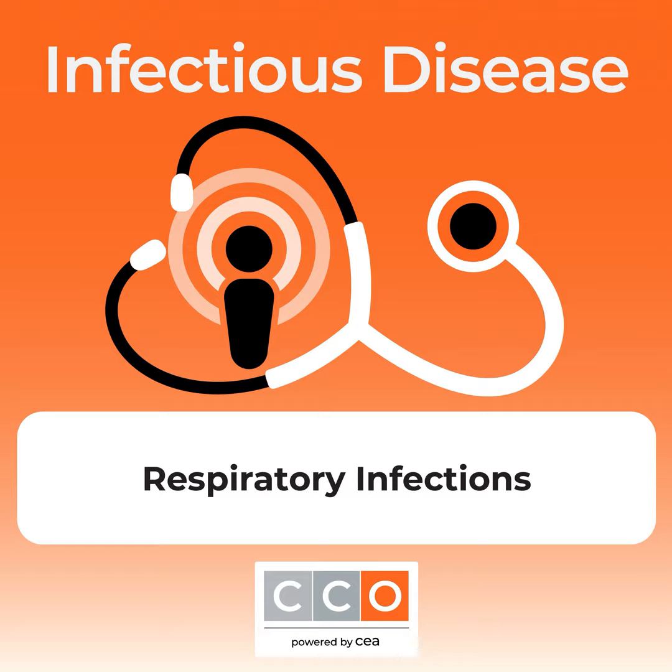There's another panel which isn't used quite as frequently, but it has some differences. It's the Unyvero assay. And so similar to the BioFire FilmArray Pneumonia panel, it detects many bacteria, although there are some differences. For example, the Unyvero assay will detect certain organisms that are not on the BioFire FilmArray Pneumonia panel. And I think one of the big ones to notice is Stenotrophomonas maltophilia. That's an important one, of course, because it's resistant to carbapenems and most beta-lactam agents. Differently, this one provides you a qualitative result, so not a semi-quantitative result.